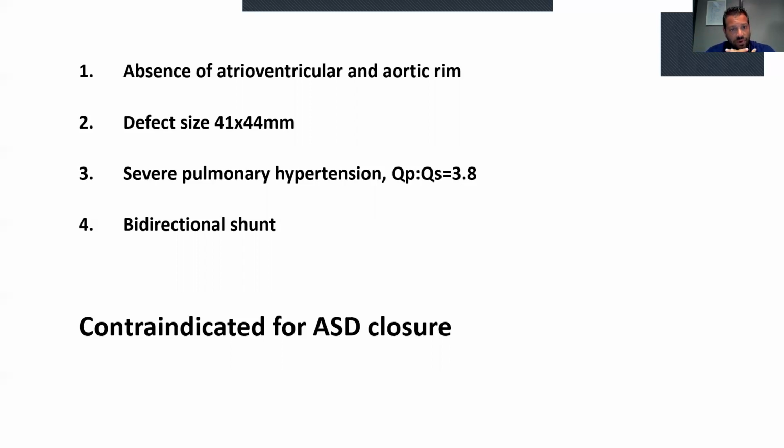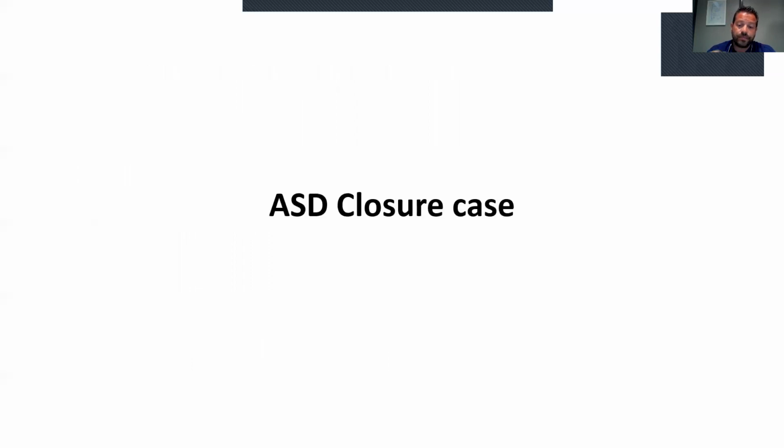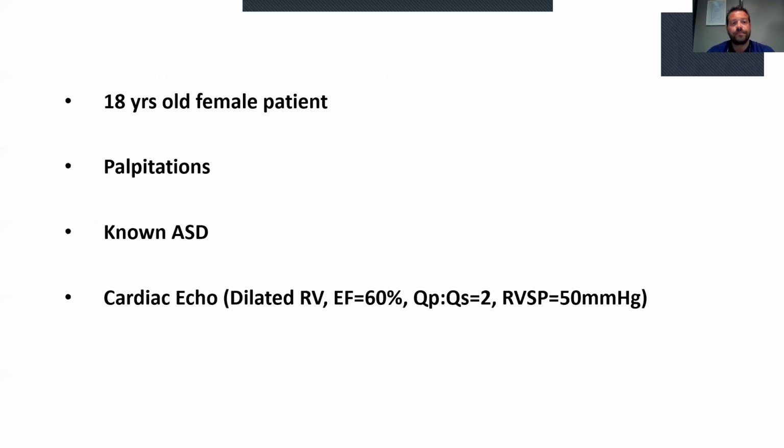So for all these reasons, this patient was not suitable for ASD transcatheter closure device, and we were not sure if he had to go surgically to close this ASD or not. So let's go to an ASD closure case.